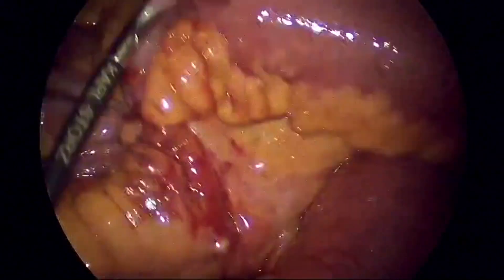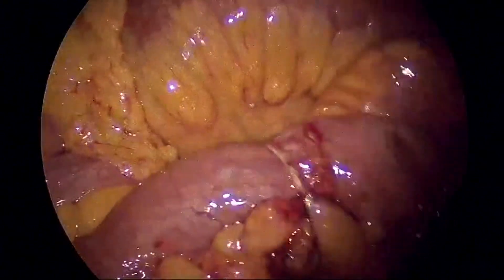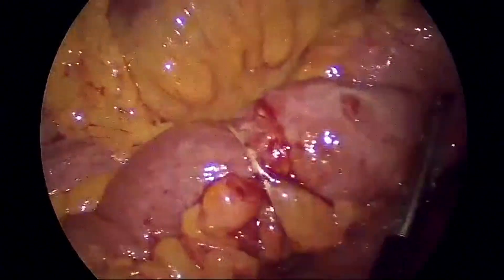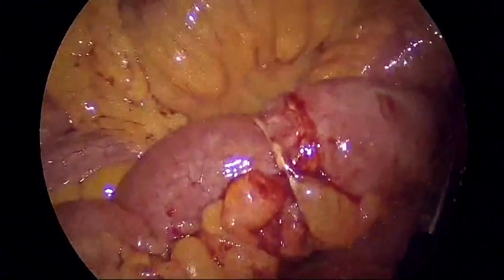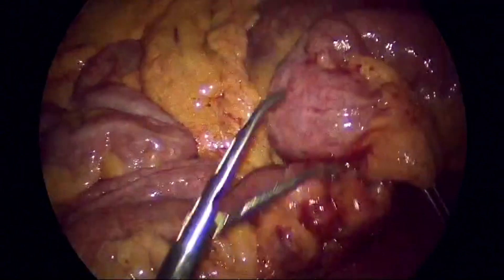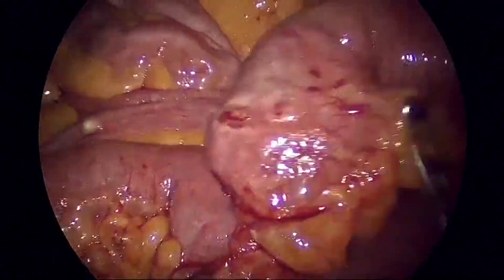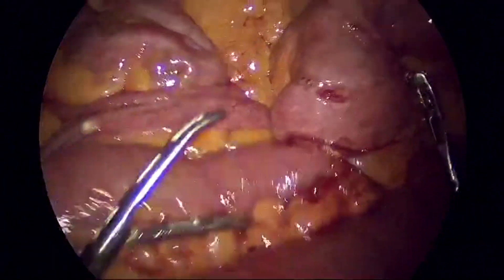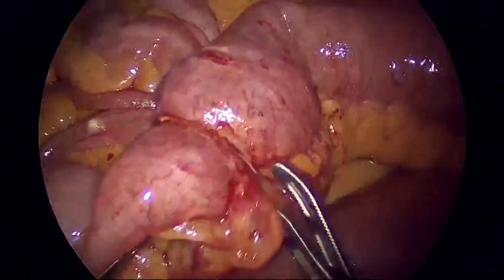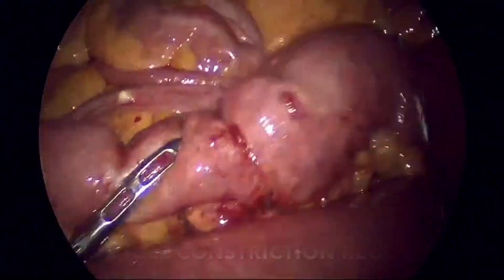After this you can see there is a band-like structure and a narrowing area. Now that the band has been divided, the bowel is normal — there is no stricture, and contents were passing from the proximal to the distal area of the ileum.